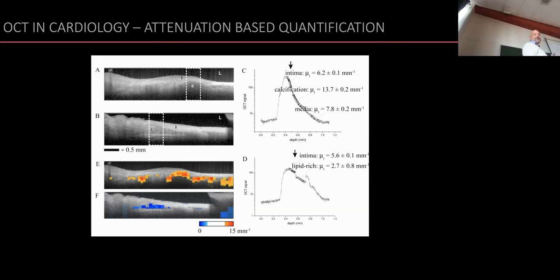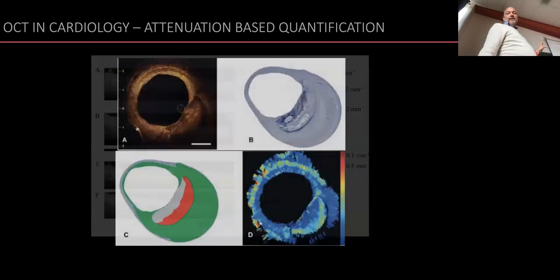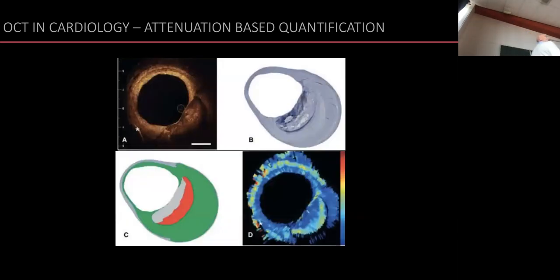I remember there were some issues with this type of data, but people have taken that work up and did it over a full circumferential scan to really look at this attenuation coefficient, creating algorithms that tell you, okay, it's the attenuation map. And in this attenuation map, you have 2 types of tissue. If you threshold that attenuation coefficient somewhere, it probably tells you, okay, there's lipid and there's calcification there, something like that. That's what they did. They compared that to histology and really could do a one-to-one comparison on, okay, is it what we study in our ends?